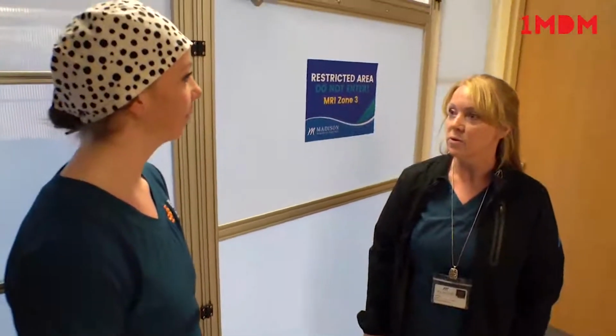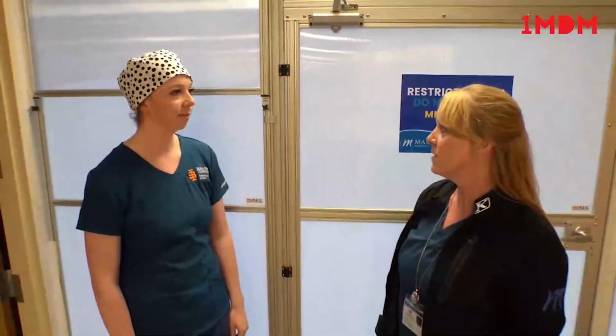Basically that's it for the study. I'll send the images over to the radiologist. He will do the report, send the report to your doctor, and your doctor should get the results within 24 to 48 hours. Okay. Sometimes usually within the next couple hours, depending on how fast the reading.